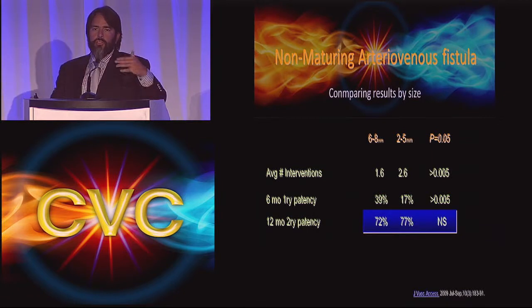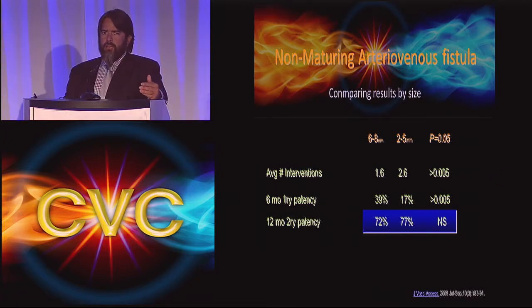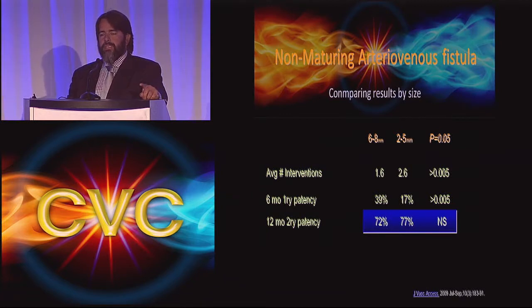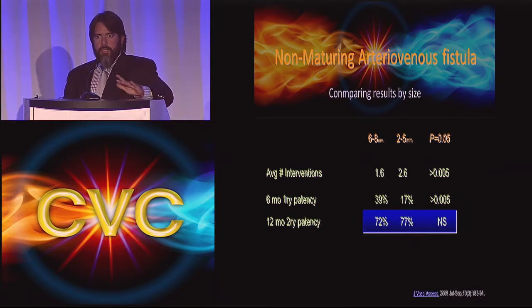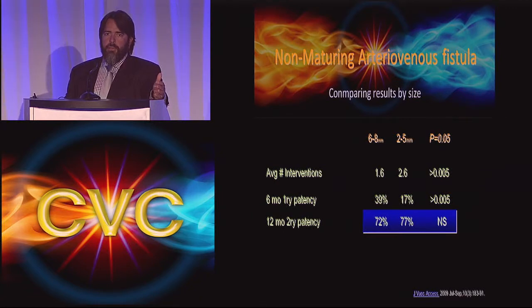So for those who construct AV fistulas, they know that you're not done when you finish that anastomosis. You know that you need to give follow-up, and they're probably going to come back, and that you're going to need to work on them to make them mature, okay? So a lot of times a patient comes to my office and they say, oh, he has such little veins, well, I put a tourniquet on, and see how much they dilate. Remember, those patients who are already on hemodialysis are volume depleted. And if your office is cold, when they do the vein mapping, plus they put that cold gel on it, you might see a vein that is like 2 millimeters, and then when you apply a tourniquet and manipulate the vein a little bit, it might go up to 3.5. I see a lot of people who come in with a vein mapping that says that it's not useful, and I will actually end up with a nice native AV fistula.